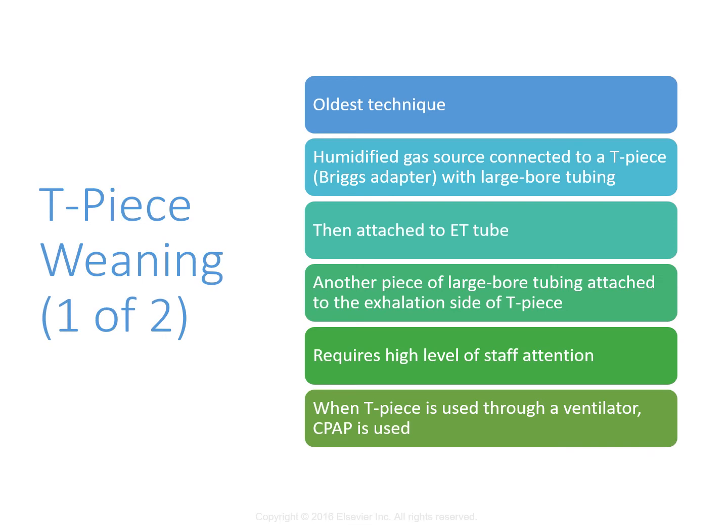So we'd have the patient on the T-piece for 30 minutes, breathing on their own, and then we have them back on the ventilator for 30 minutes, right? So they kept doing this until the patient would breathe on their own for an hour, and then sometimes even longer than that. So that's not how I T-piece weaned, of course, but that was the history of T-piece weaning.